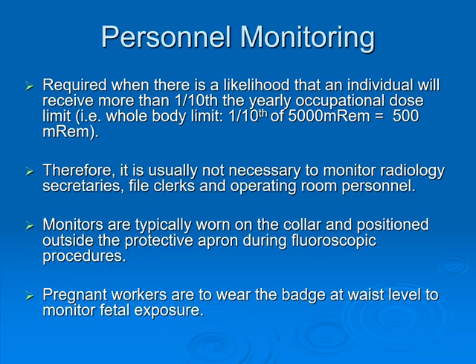Generally, personal monitors are worn on the collar and positioned outside the protective apron during fluoroscopic procedures. Pregnant workers are to wear the badge at waist level to monitor fetal exposure.